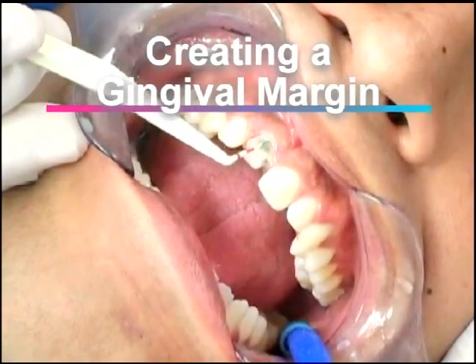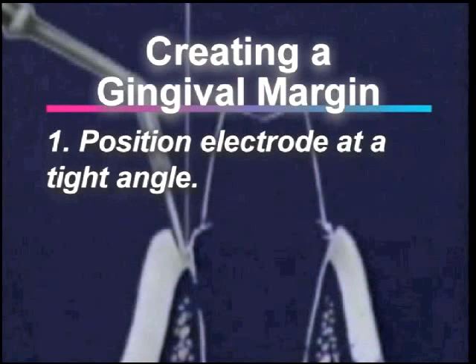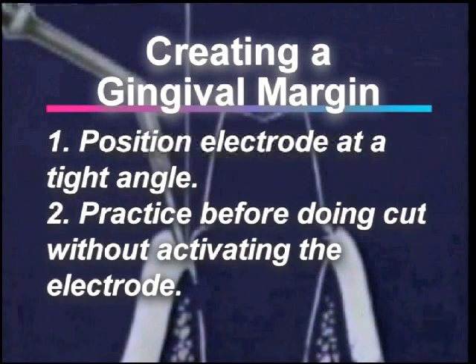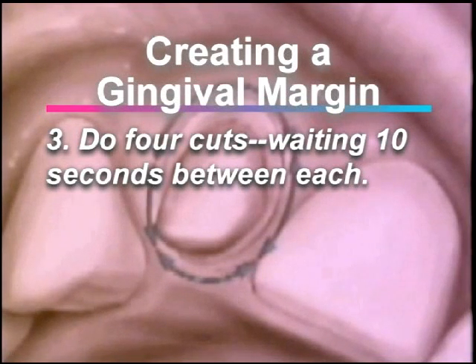The following are important points to remember when creating a gingival margin. One: position the electrode at a tight angle — this will create an effective margin and preserve the gingival height after healing. Two: before doing the cut, do some practice strokes without activating the electrode. Three: do four cuts, waiting 10 seconds in between them instead of doing the cut all at once.